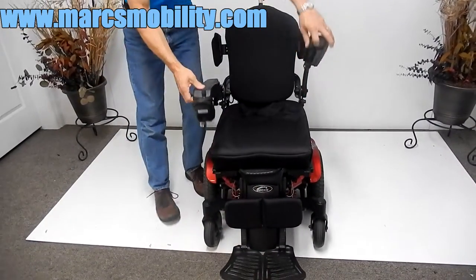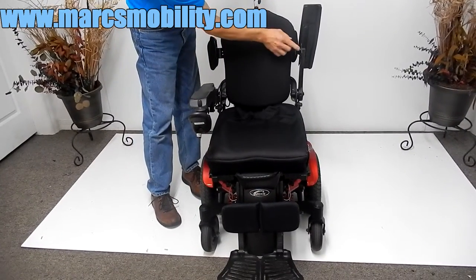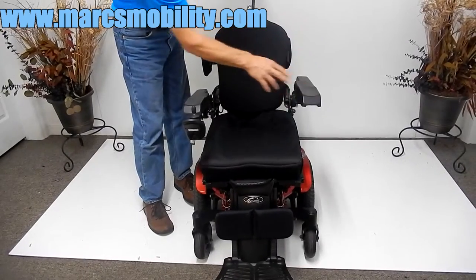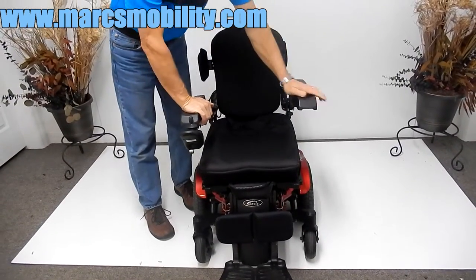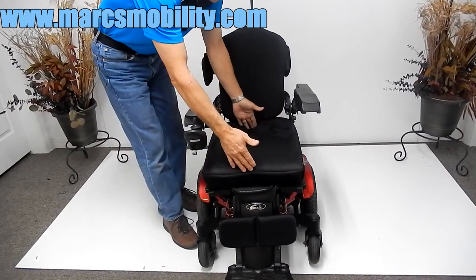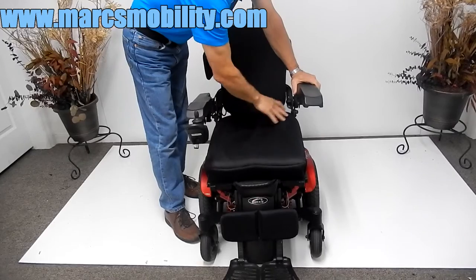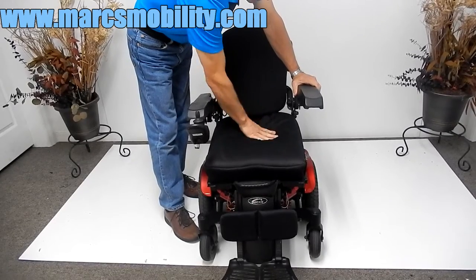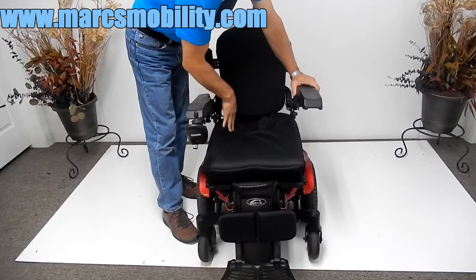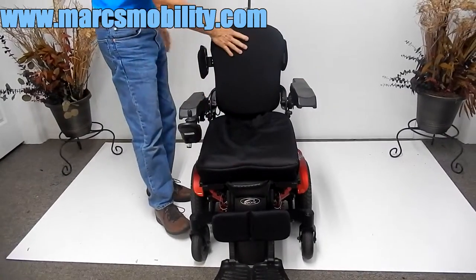The arms are adjustable up and down, and you can adjust the tilt of the arm right here. There are several adjustments for tilt and they're very solid arms. The seat on this chair is 17 inches by 18 inches. It has a foam cushion with some kind of gel back bottom for your back — nice cushion, nice soft back.